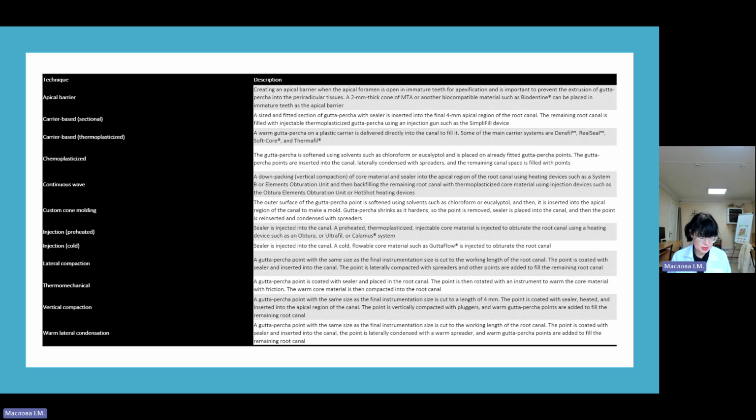Acrylic points. Acrylic points are colored, coated and radiopaque. They are made of methyl methacrylate polymer, bismuth oxide, zinc oxide, and cadmium-free coloring agent. As a rigid core material, they are made to offer all of the advantages and none of the disadvantages of silver points, and they are promoted as being removable with either solvents or essential oils if retreatment is necessary.